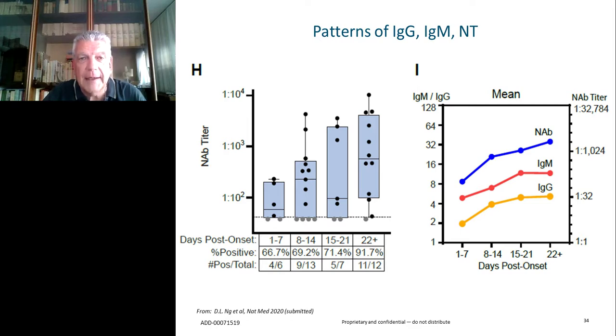So we are going back to the original observation in which we have hinted that a good and strong serological response by any assay, so even by a nucleocapsid targeting assay, will relate to the neutralizing activity. Then, of course, we cannot stretch it to demonstrate neutralization just by testing for binding antibodies, but it gives a justification on the correlation we may find in different experiments.